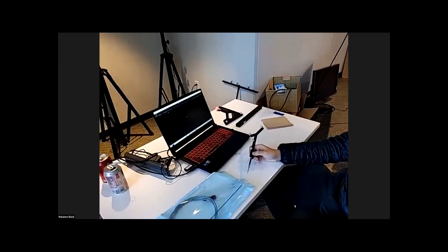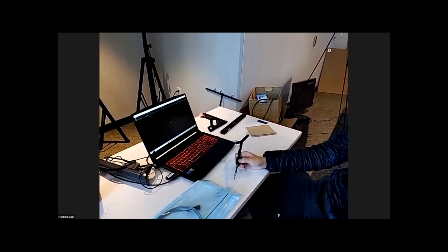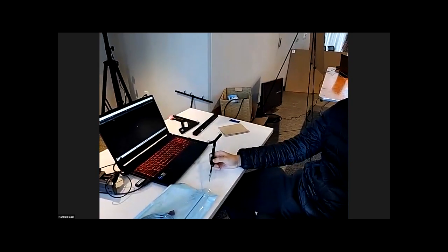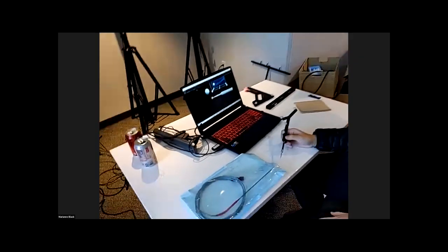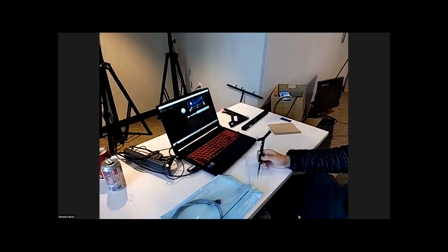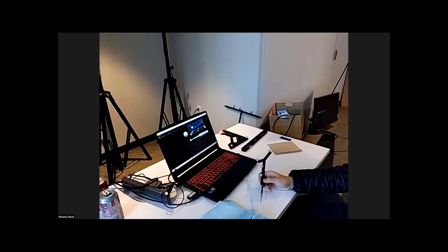Are you doing this in real time relative to the static reconstructed image? I think it's the MRI image, it's static. But you could do it in real time with ultrasound, maybe, if you could get a good enough image. Maybe, questionable future research. The rationale behind this is that surgeons do the planning based on preoperative imaging, so we're trying to relay that back onto the patient body to use during the procedure.